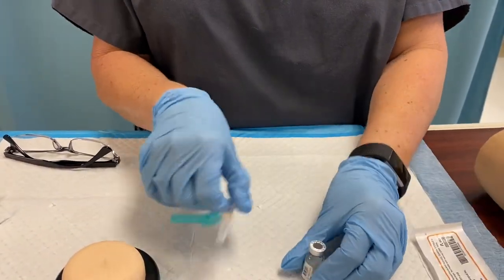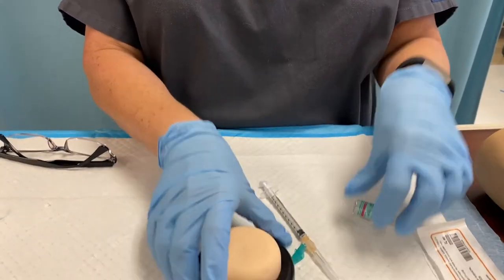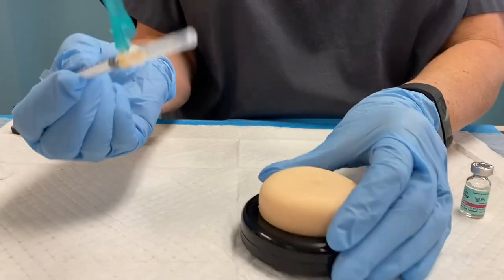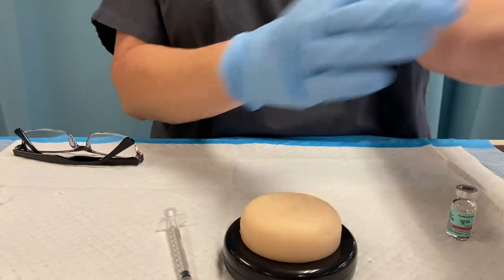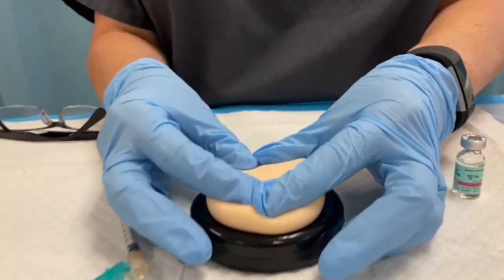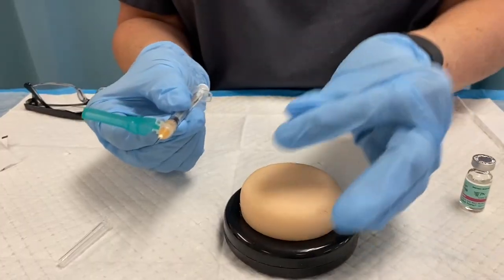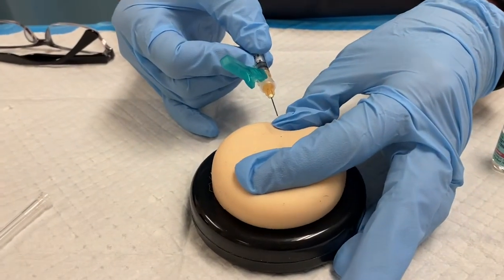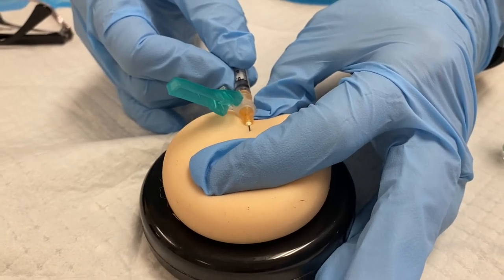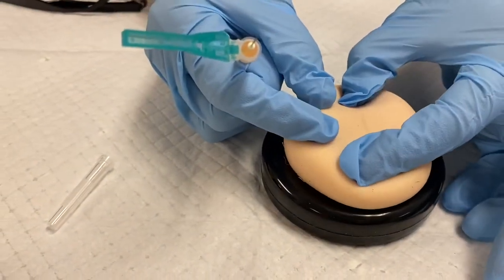With our intradermal, our angle is going to be from 5 to 15 degrees — it is actually almost parallel, just slightly up from the skin. With an intradermal injection, we're actually going to pull our skin taut so we can stabilize our skin. Because what we're doing with the intradermal, we're going to be injecting that bevel into that first layer of skin and not inserting the whole needle. It says intradermal — you're going into the dermis, that first little layer. You will pull the skin taut.